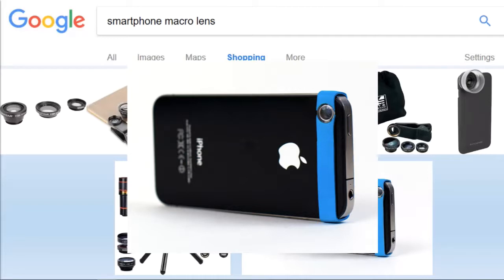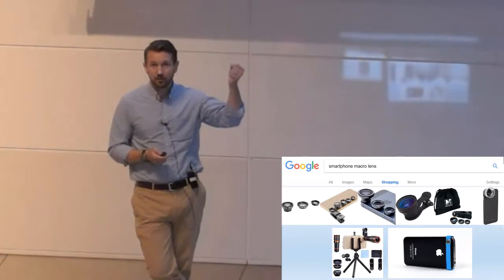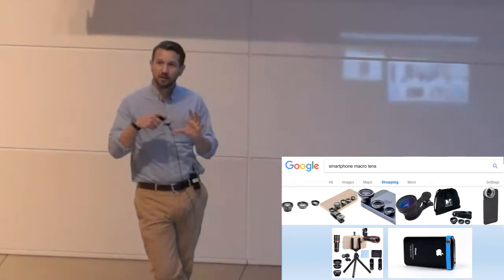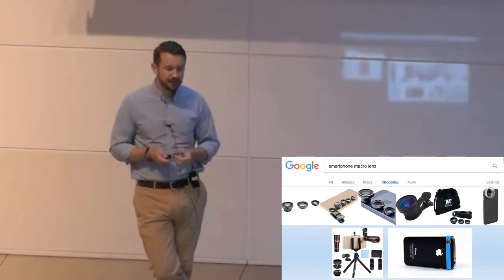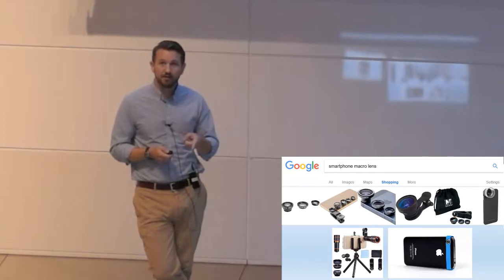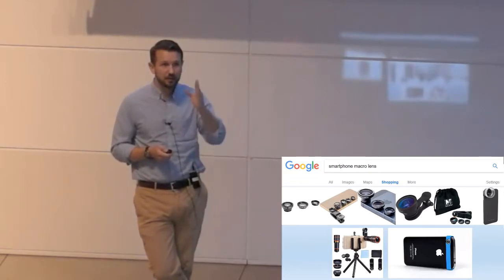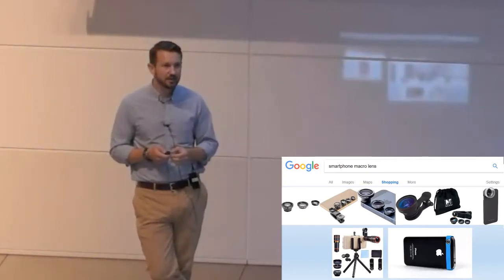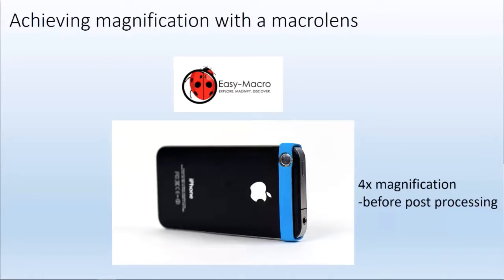This is where I'm rarely saying keep the room lights as bright as possible or use an overhead surgical light to illuminate the eye. When I do these images on my own, I will have someone with a transilluminator illuminating the eye. I'll show you that technique in a second, except for the iPhone 10. They've got vertical cameras, and the LED flash on the back of the phone is not covered by this. You just put a piece of tape over it so that it's not as bright. If you want to write down this, if you don't get a chance to get this afterwards, it's Easy Macro.